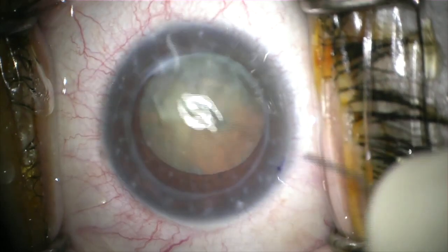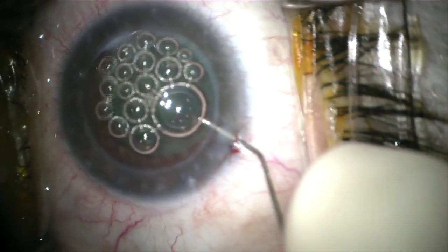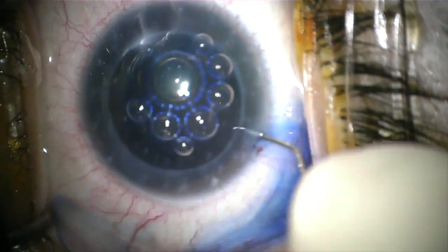This is Dr. Ashley Brissett showing some important considerations when performing cataract surgery under a corneal transplant, because you want to ensure long-term survival of the corneal graft. The irregular astigmatism and also the graft-host junction makes the view more challenging in these cases.